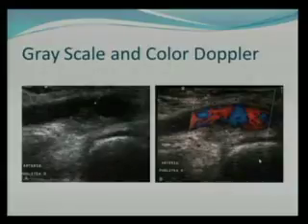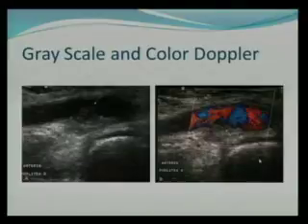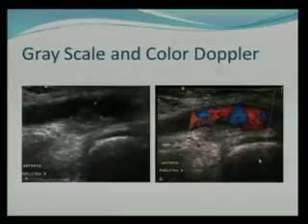So what do we see here on this patient? You see this patient on grayscale imaging. We see this intraluminal echo right here, and this is by the posterior wall of the popliteal artery. And when you do this color flow, you can see that this intraluminal filling defect persists. This is the popliteal artery, and this is in Spanish, right, Dr. Yeah. So this is the popliteal artery, and there's color flow aliasing here, telling you that this is a real clot, and it may be hemodynamically significant because there is color flow aliasing.